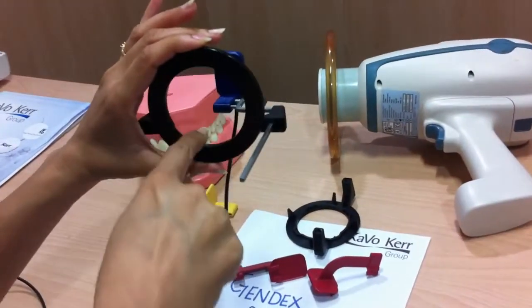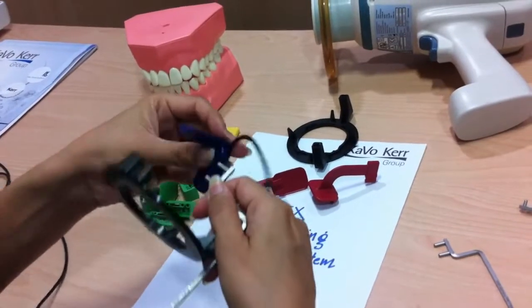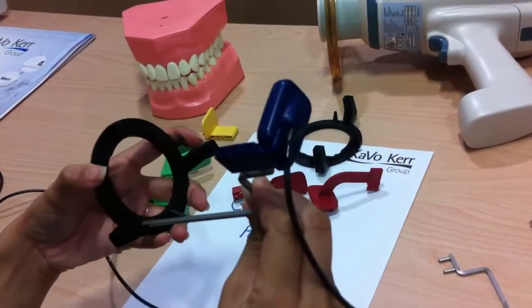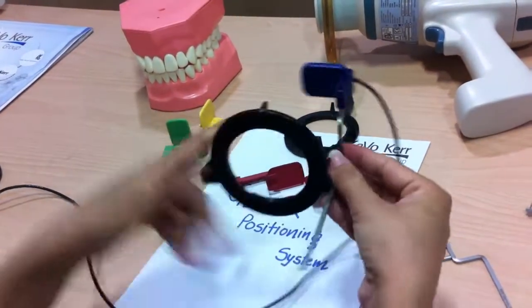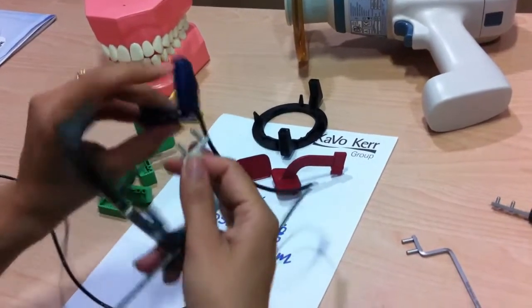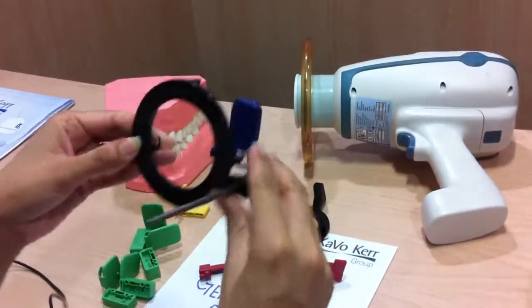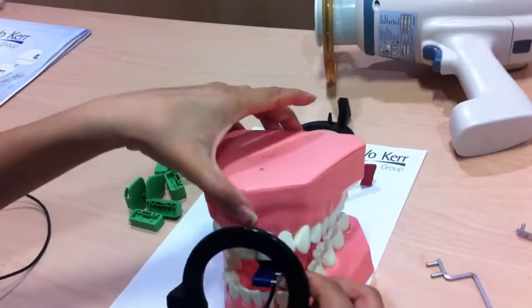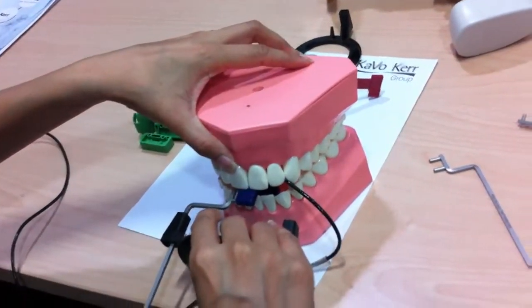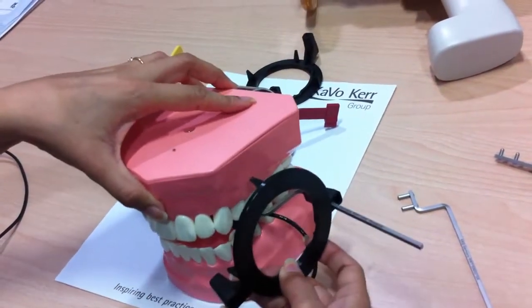Again, the sensor should be in the center of the aiming ring. The most common misconfiguration is aligning the sensor or bar incorrectly — that is not the correct position. The bar should be positioned properly and the sensor should face up. The thumb rule is that it should be in the center of the ring. This configuration is used for both upper and lower, including the canine position on the upper and lower sides.